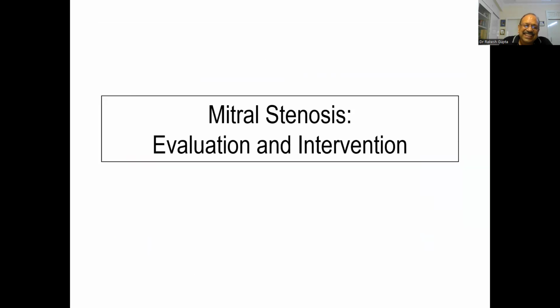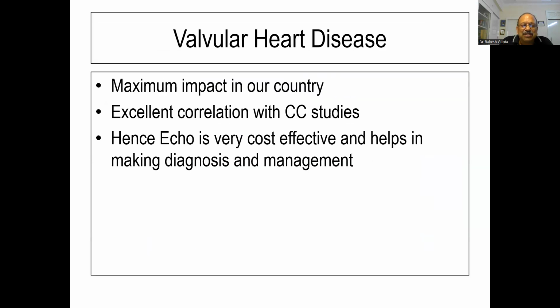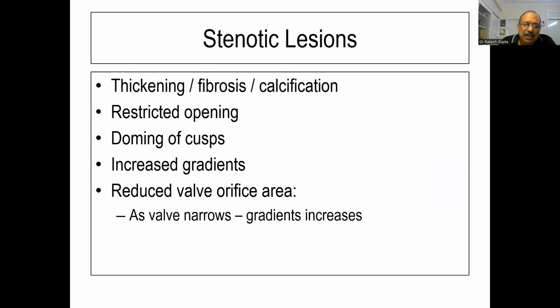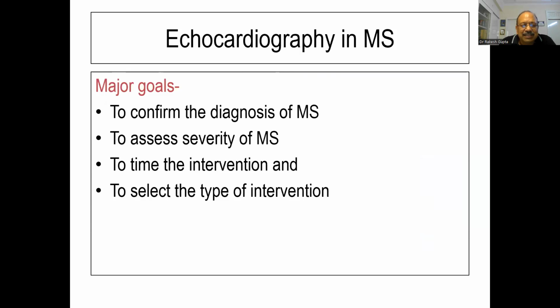So, sir, these are not useful now. They are useful, but this only guides you. Today is the era of quantitation, not of qualitation. And I can give you a mitral area. What else do you want, DF or EF slopes? Okay, sir.